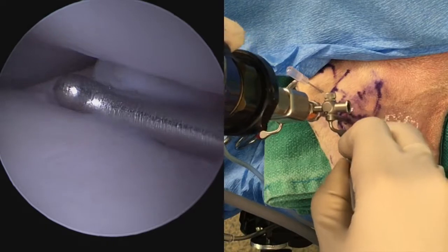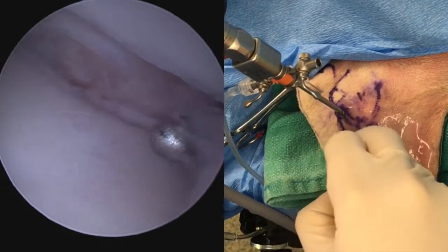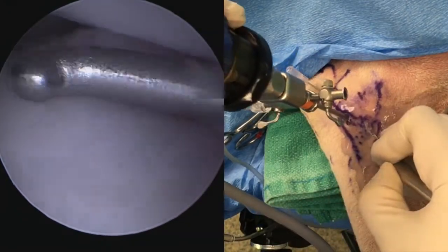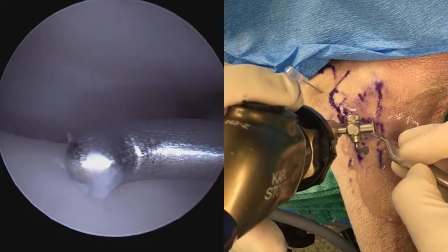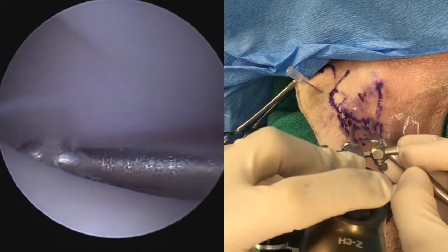Probing is performed first. Here we can see the probe placed right in the fissure region between the fragment and the rest of the coronoid process. Cartilage is palpated over the region. We can see a little bit of iatrogenic injury to the cartilage, which we want to avoid as much as possible.